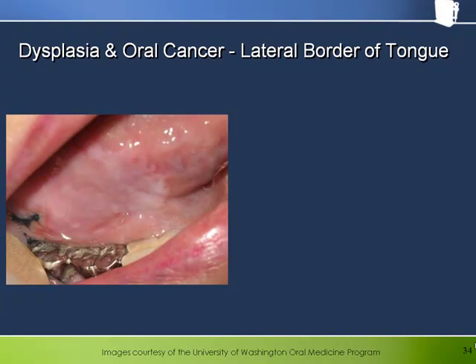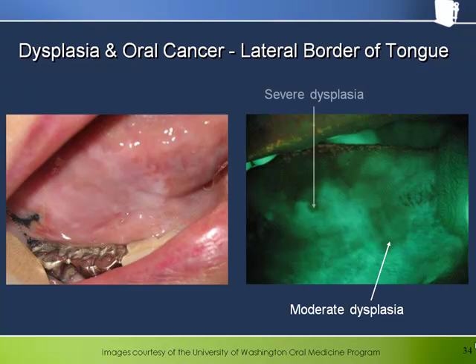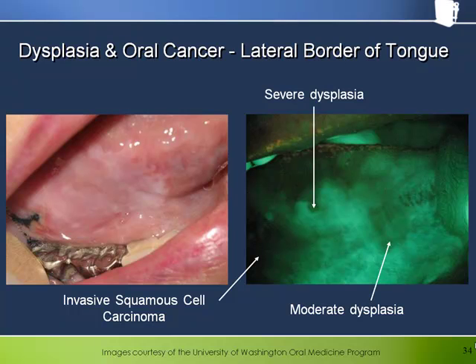Here we have a large area of leukoplakia on the side of the tongue, but this time the lesion morphology appears different with fluorescence compared to white light. Under Velscope, parts of this area show up as brighter due to keratin fluorescence, but the areas indicated by the arrows are, to varying degrees, darker under Velscope. The slightly less dark area on the right-hand side was found to be moderate dysplasia. The smaller, very peculiarly shaped darker area more toward the top of the tongue was severe dysplasia, and the very dark area posterior to these two areas was invasive squamous cell carcinoma.